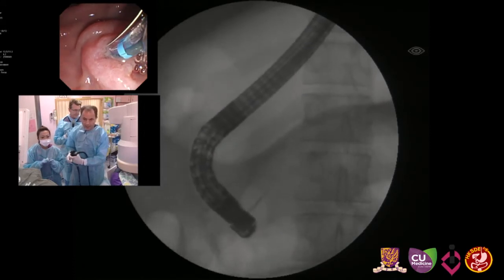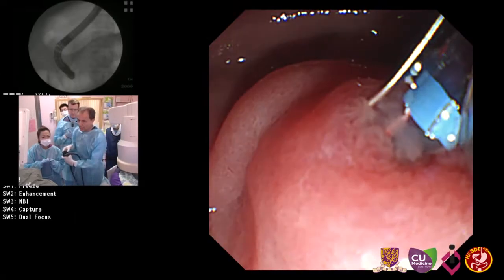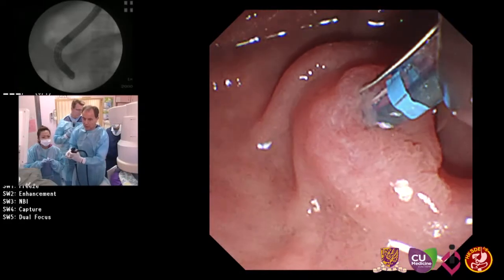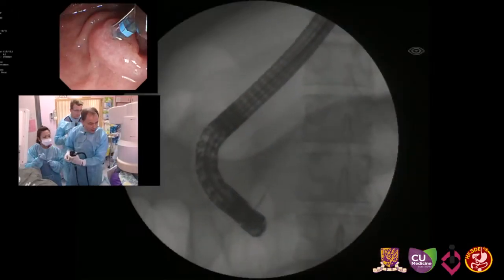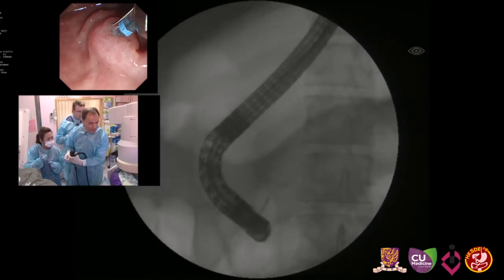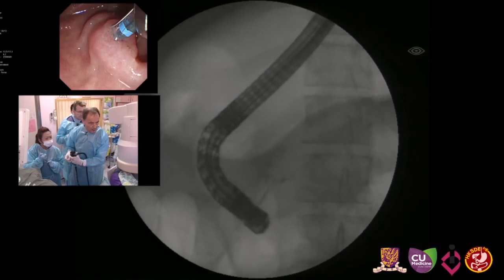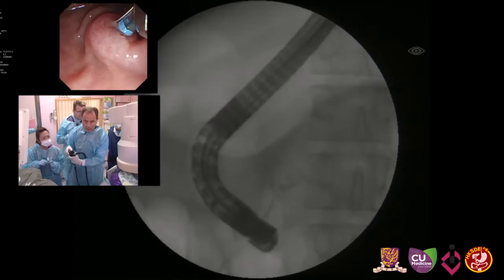Okay, then I think this is always the discussion, which I think is a little bit artificial: guide wire first or injection. We need some injection now at this stage to see the anatomy. So inject anyway, a little bit. It's chronic pancreatitis, so we don't have to worry. Injecting? Yeah, so we see there's a stone. The stone is just in front, obviously. Can you see that? Yes, we can. Okay, this will be very difficult to overcome.